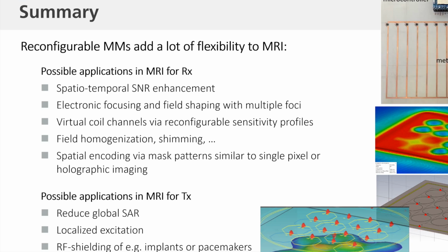his 7T system, where Siemens designed a gradient coil with, I don't know, 400 millitesla per meter, and what was it? 4 times the switching rate. So it's really incredibly fast, and they put in an effort worth 2 million euros to get just the stimulation away from the neck and shoulder region. So they had to invest quite a lot in there.